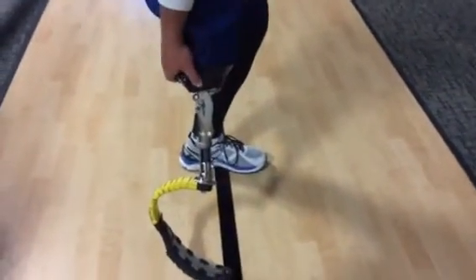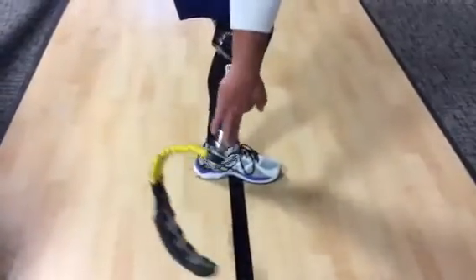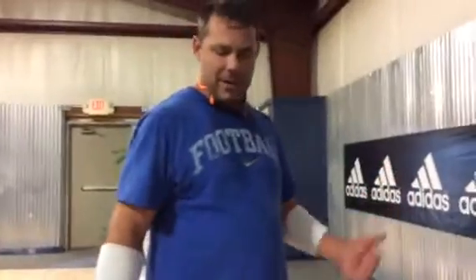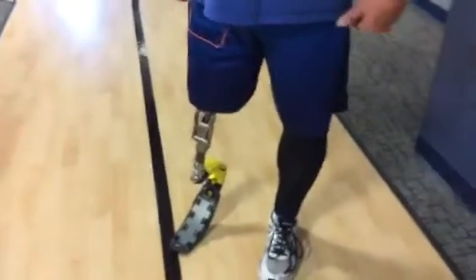If you look on the back of mine, I have a big rubber bumper on the back. What that does is it allows that leg to come up only a short distance and then throw back out. You can even duct tape a tennis ball on there, so that way the leg doesn't come too far back and it throws it back out in front of you, just like your real leg will be kicking out when you are running. This is much harder and it takes a lot longer and a lot more strength in order to build up your stamina.